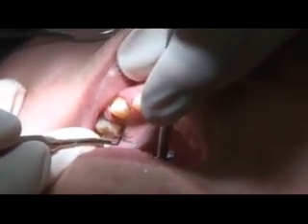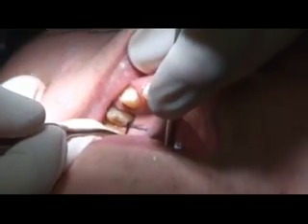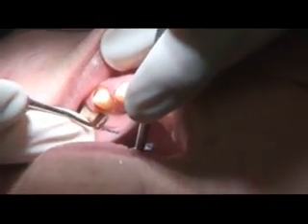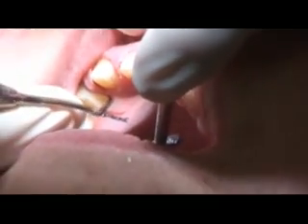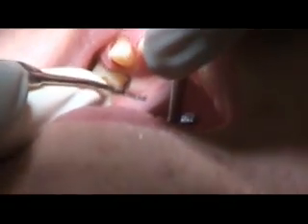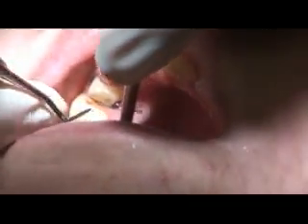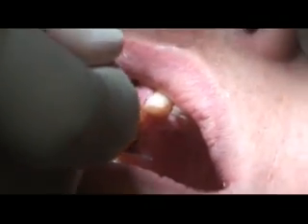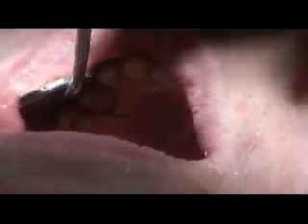That one's being a little tricky on me right there. We'll show later on a drawing or on a typodont how we can position our cord packing instrument. But you guys want to make sure you're positioning the cord packing instrument into the sulcus and against the root. Sometimes people get confused and poke straight down, and that can cause damage to the gum tissue. We don't want to do that. Those are the correct places to place our instrument.